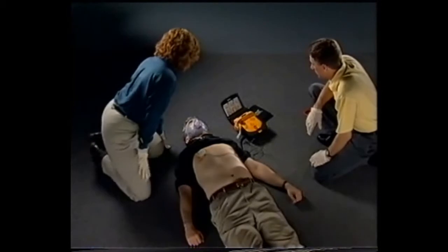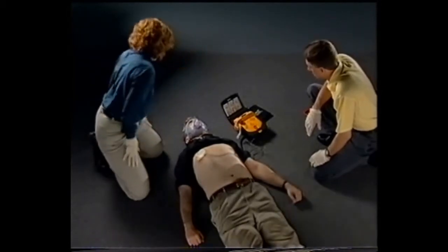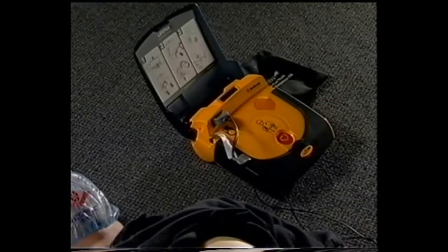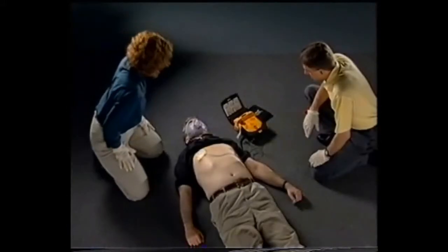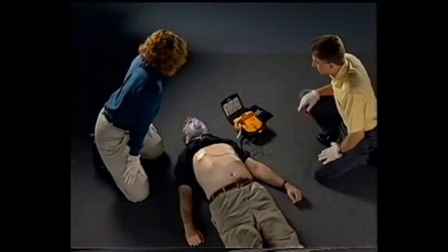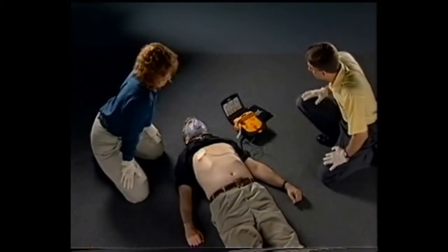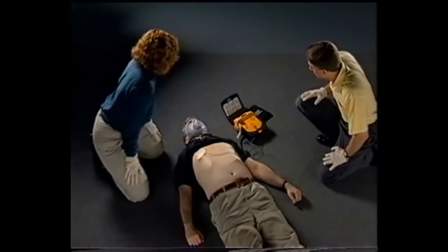After the shock, the defibrillator automatically evaluates the heart rhythm again. It will determine if another shock is necessary. "Do not touch patient. Evaluating heart rhythm." If it is, the defibrillator will repeat the entire shock sequence. In this case, the defibrillator detects that another shock is not needed. "No shock advised. Check for breathing."